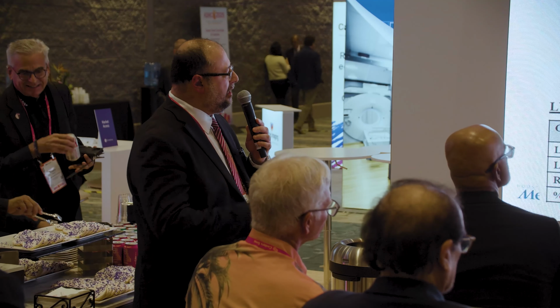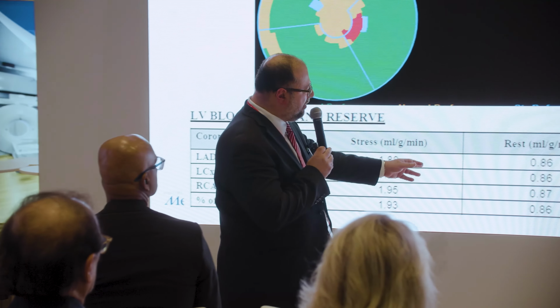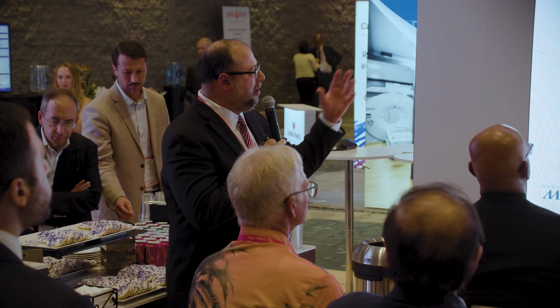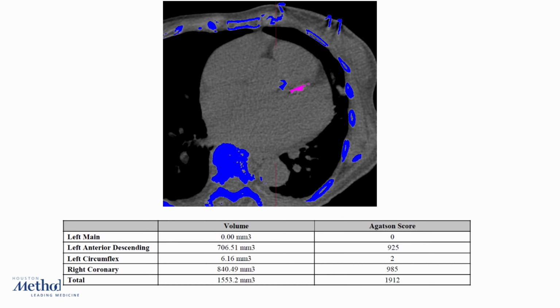And now this is the map of flow. So you can see that this patient's resting flow is normal, the hyperemic flow is also normal, the global flow is normal. But when I look at the regional, now I see that the area of perfusion defect has reduced myocardial blood flow. So this is something to keep in mind. It's the same area that correlates with the perfusion defect.